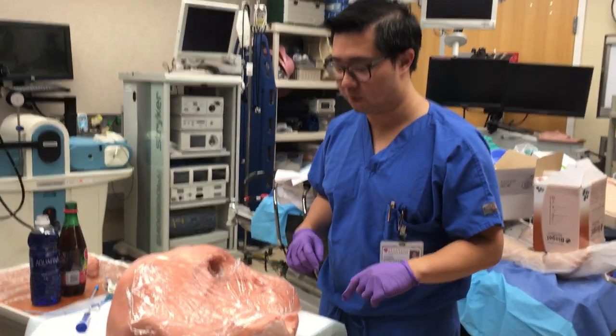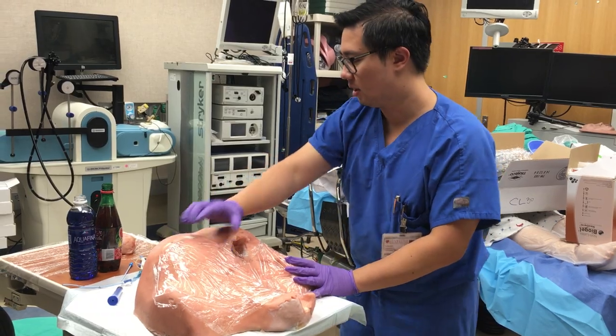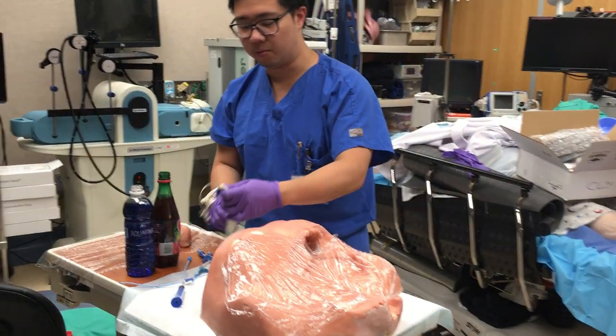This is the central line model, the MoVat model that we're making. As you can see, our bust — we have it wrapped with saran wrap. Over here, we have the MoVat tubing.